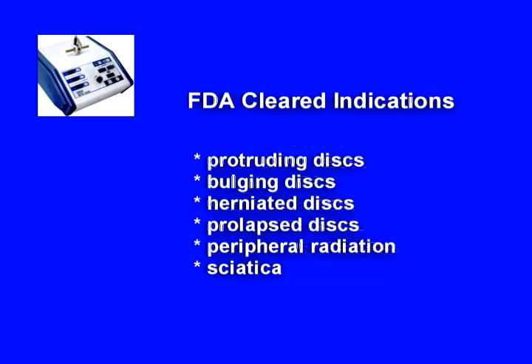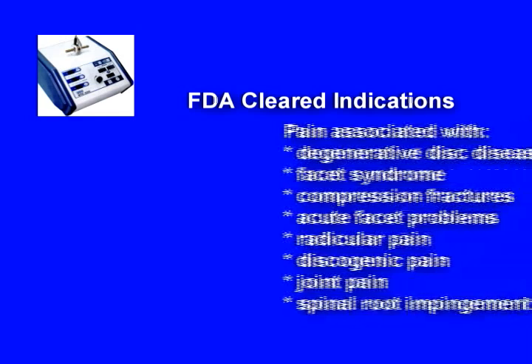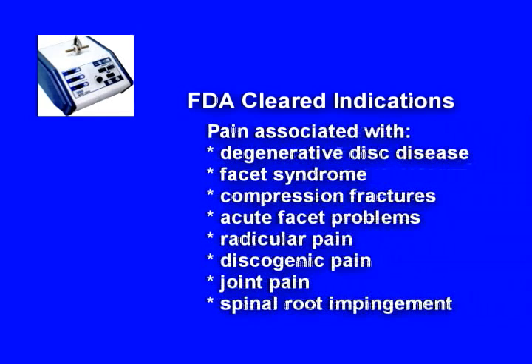The MTD4000 may be used to help relieve protruding, bulging, herniated, and prolapsed discs, peripheral radiation, sciatica, and pain associated with degenerative disc disease, facet syndrome, compression fractures, acute facet problems, radicular pain, discogenic pain, joint pain, and spinal root impingement.